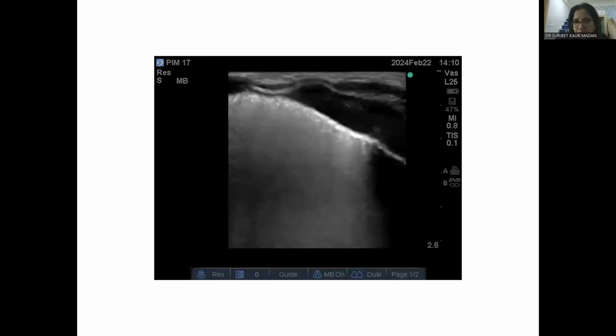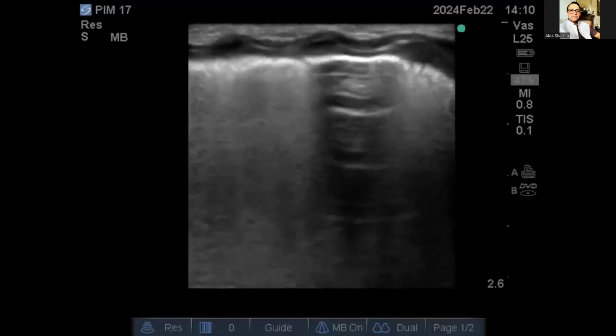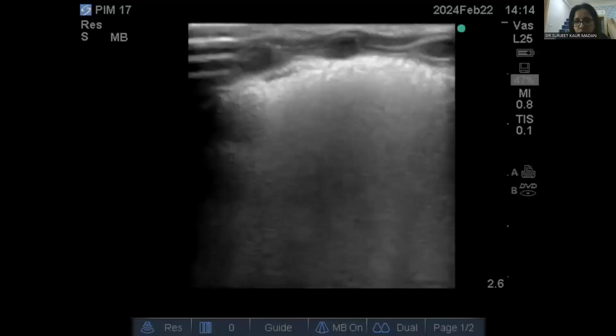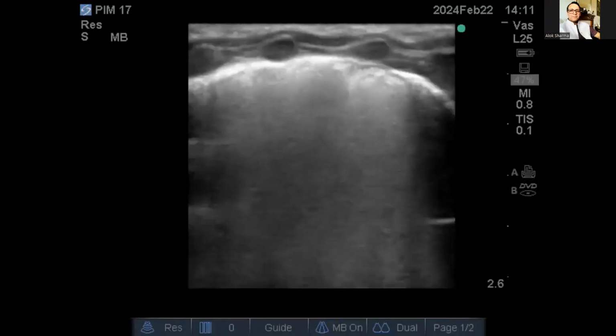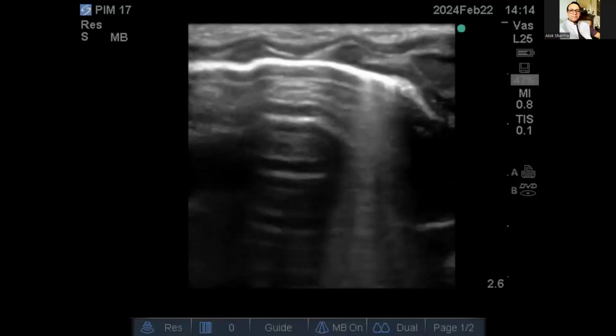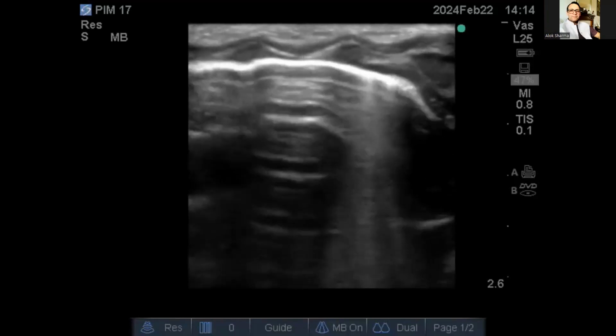So this I'll take as 3. Yeah, I'd probably say 2. I'm not convinced you have clinical atelectasis. Okay, so this is also 2. So it's 4. This will be 0. So it's 4, and again this is 2. This is 6, and this is again 2. So it's 8. This I think we can take as 1. So the score would be 9.